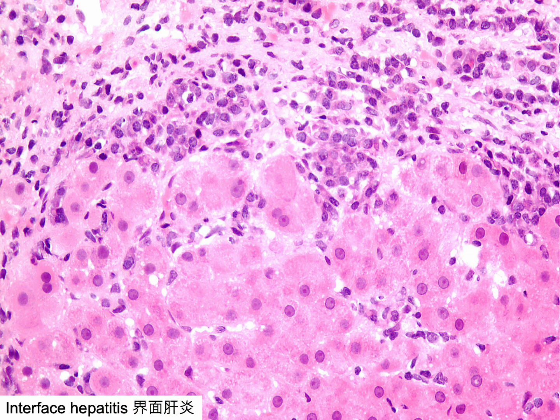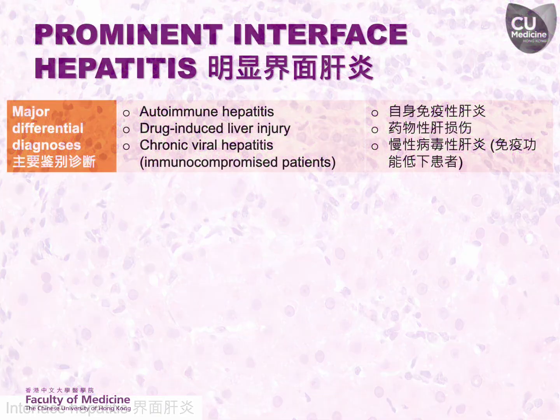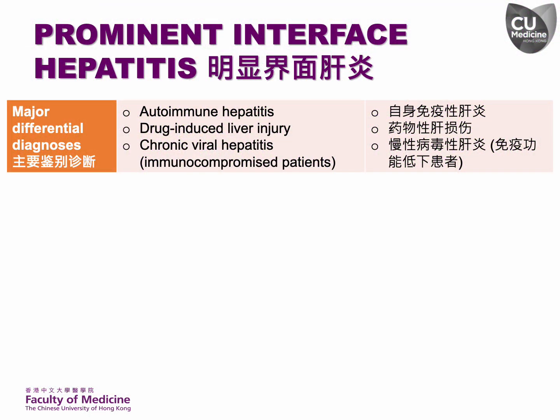This is an example showing prominent interface hepatitis. Although prominent interface hepatitis is typically regarded as a hallmark feature of autoimmune hepatitis, it can be observed in any acute or chronic hepatitis with high disease activity, including drug-induced liver injury and chronic viral hepatitis with high activity, especially among immunocompromised patients.